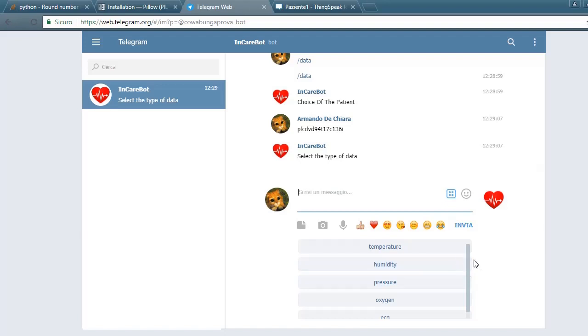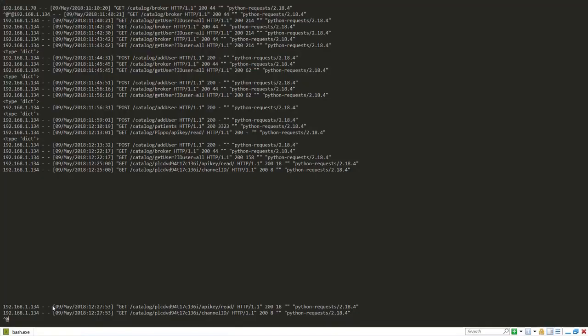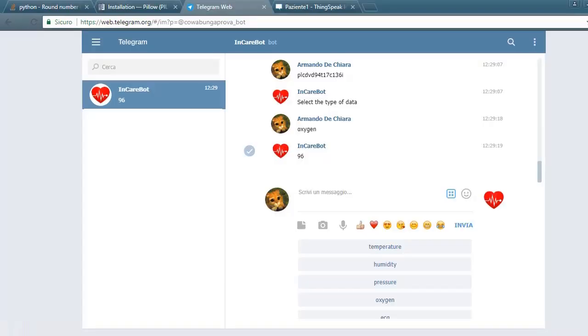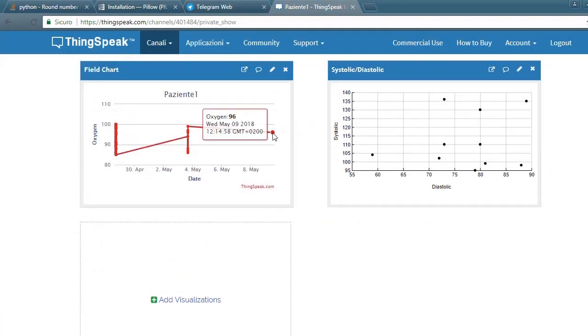Once we press one of these buttons, for example oxygen, the Telegram bot retrieves the API key for the patient channel on ThingSpeak from the catalog. As we can see, the catalog has received the request for the API key and the channel of ThingSpeak. Telegram returns the last measure recorded from ThingSpeak of the oxygen, that is 96. Now we can check if this is really the last value from ThingSpeak, and it is.